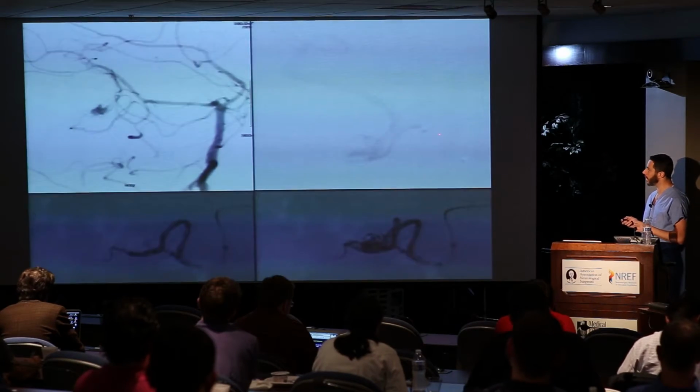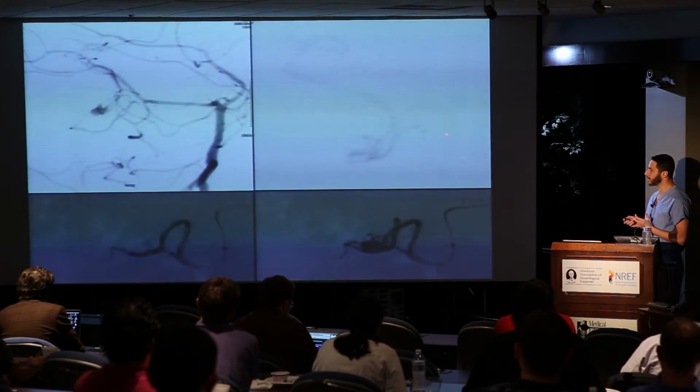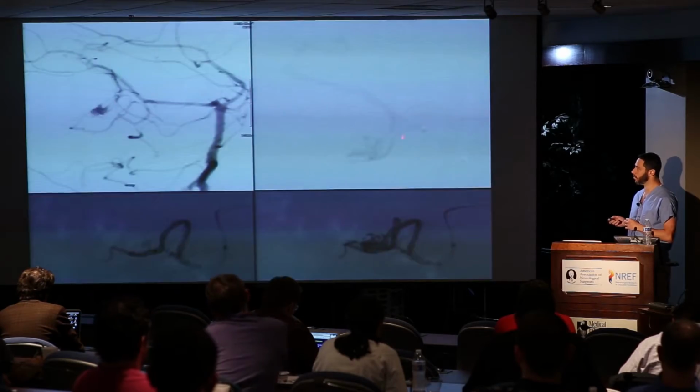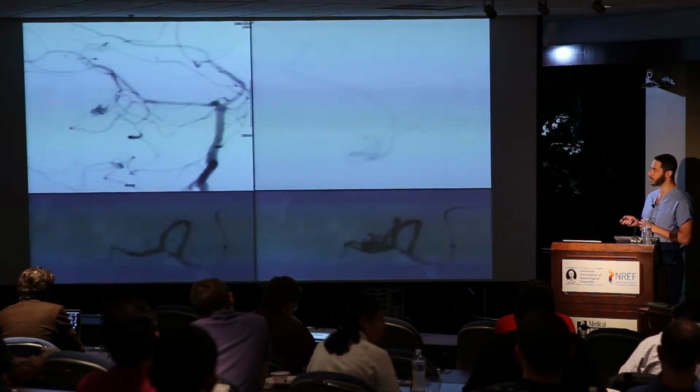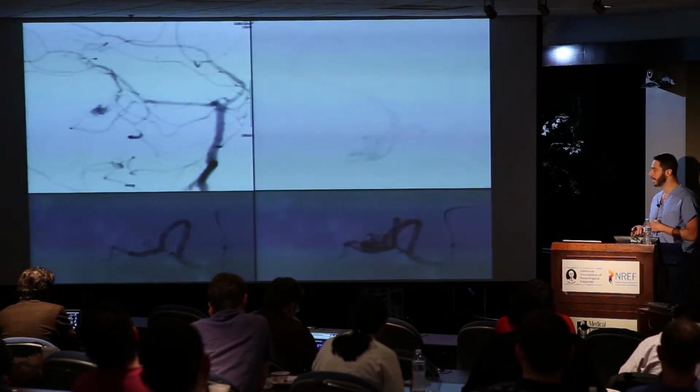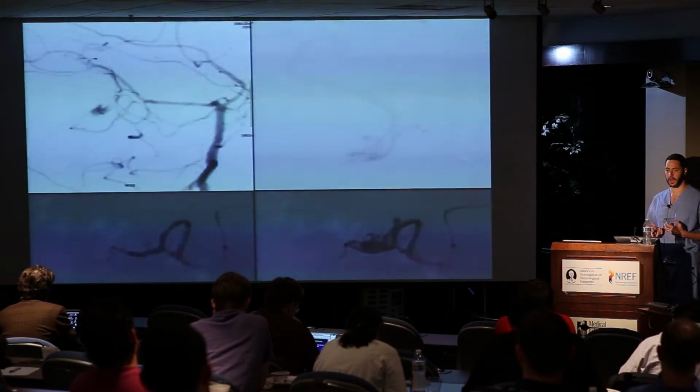This picture is to show you, it's not very dense in contrast, but you need good microangiography to know where you are, and you should really work your way to the nidus. Here, there's a short distance to the nidus. I often take multiple microangio runs before I get to the place where I'm satisfied that I can embolize and also understand the situation.